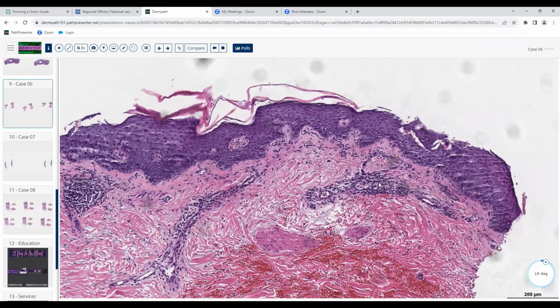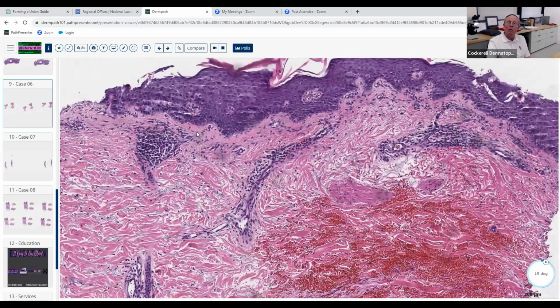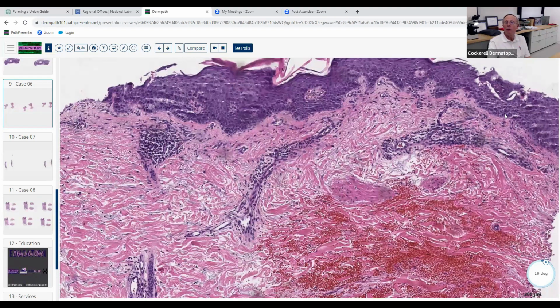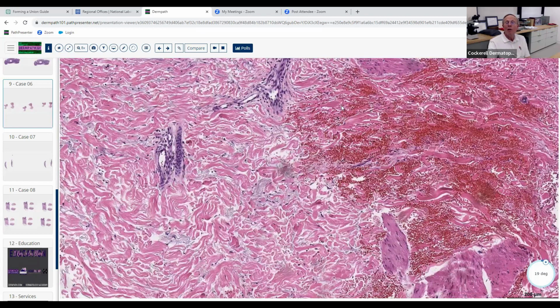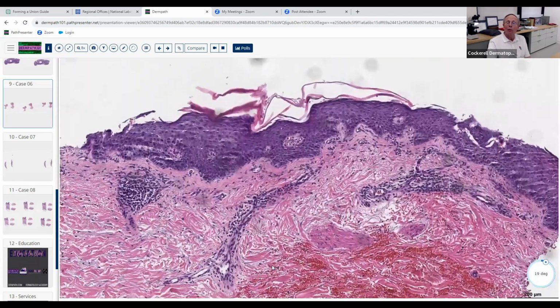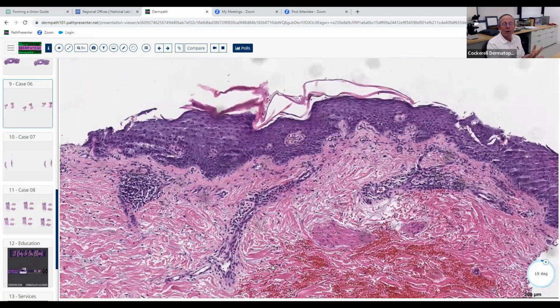Not at all. But based on this, what is your differential that you think about when you see this mostly perivascular lymphocytic infiltrate without a lot of epidermal changes? And there's a little bit of deep involvement here. So what are a few things that you're going to think about? And then you're going to look over at the pathology requisition slip, and they're not going to be someone who just put rash unspecified. They're going to give you something that they think clinically, and then you're going to say, ah, yes, it could be that.